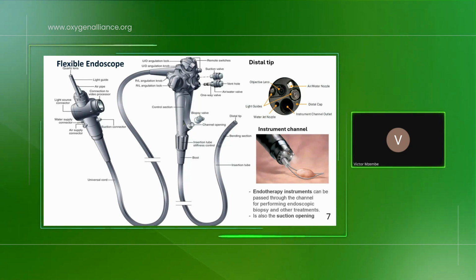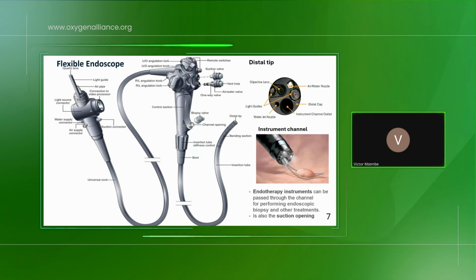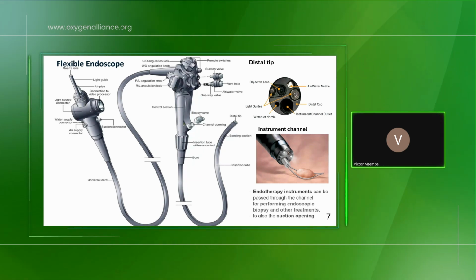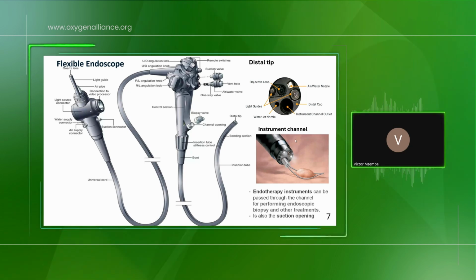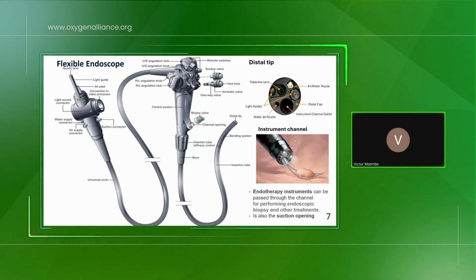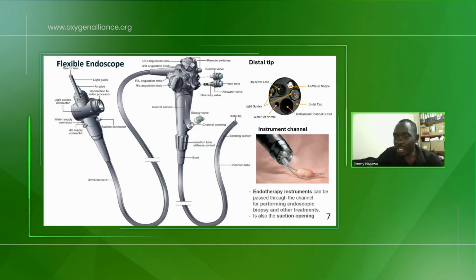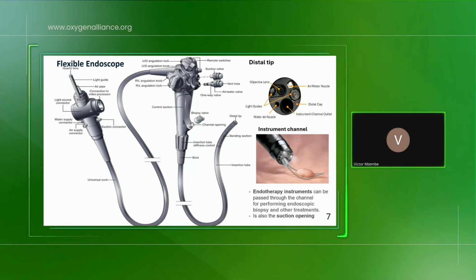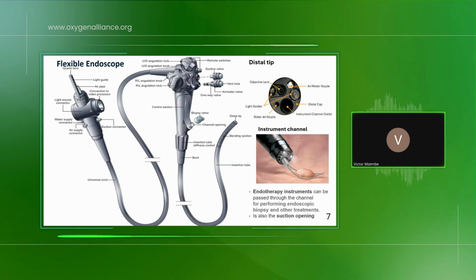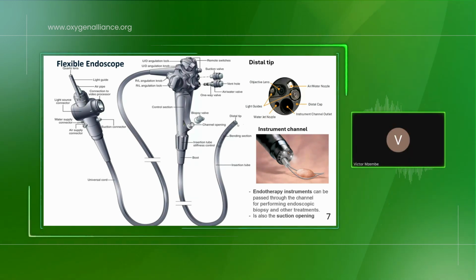That's a brand. I think this one is also Olympus. And it's saying what is spoiled on the Olympus? It's saying pigtail. I'm sorry, I'm not capturing that word very well. Pigtail. Yes, so the pigtail is spoiled.